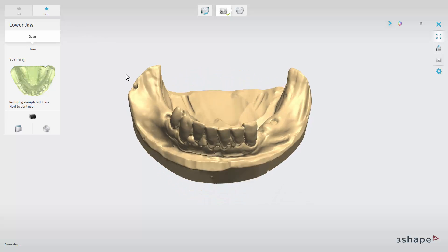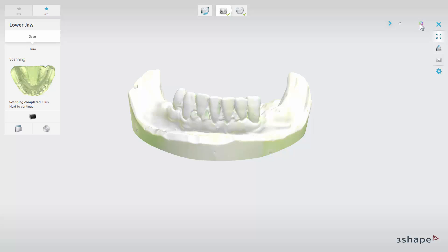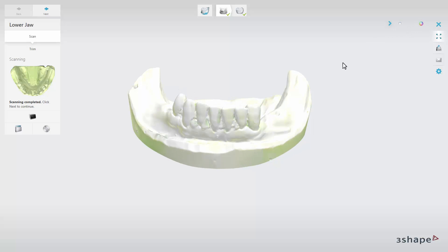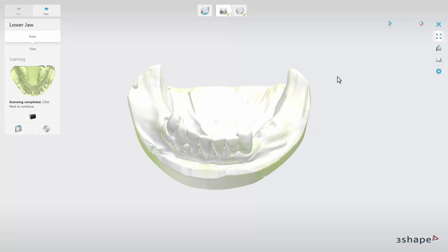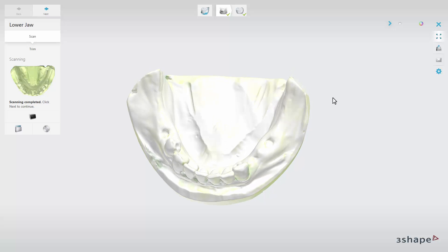While designing the RPDs, it can be very helpful to switch on the option Show Texture. As you can see here, the scanned model has real colours now, but still doesn't give us any useful information about how to perform the design.